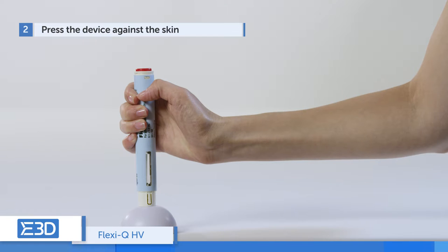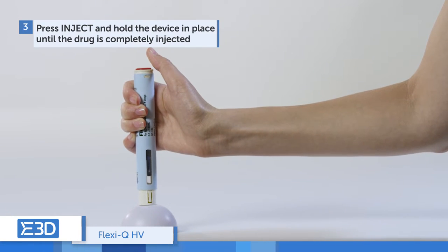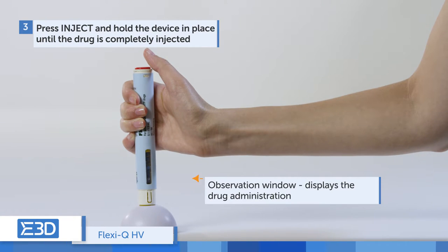Press the device against the skin. Press the inject button. The drug is automatically injected after full needle penetration. The drug administration can be seen through the observation windows.